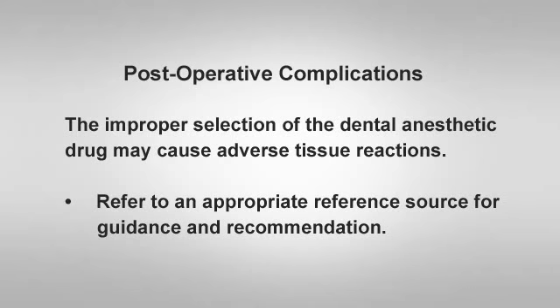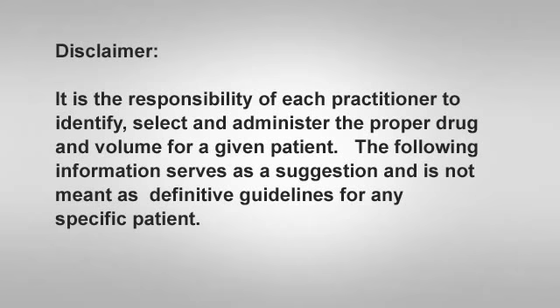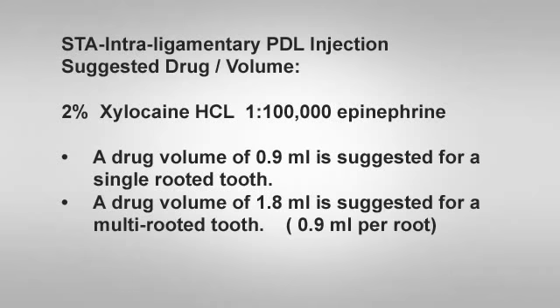Please refer to an appropriate reference source for guidance and recommendation pertaining to local anesthetic solutions and specific volumes for each injection. It is the sole responsibility of each practitioner to identify, select, and administer the proper drug and volume for a given patient. The following information serves as a suggestion and not meant as definitive guidelines for any specific patient.